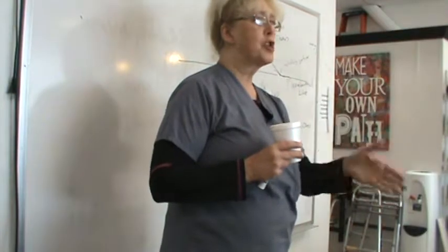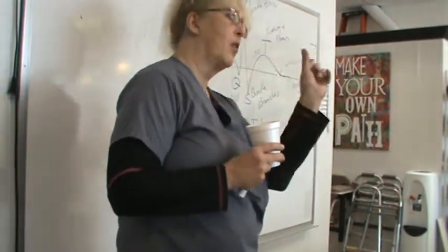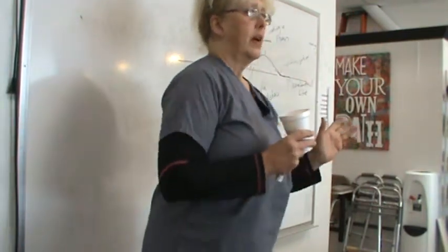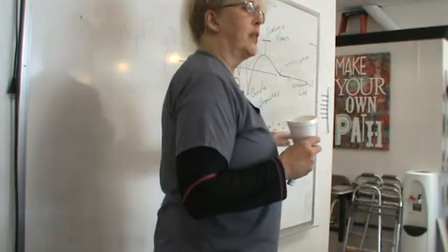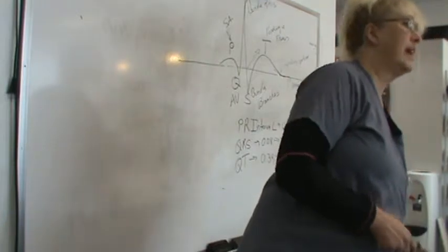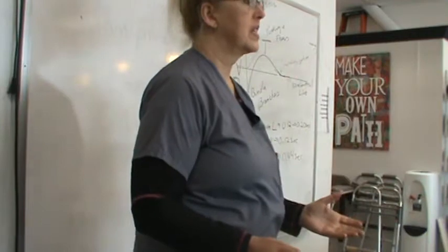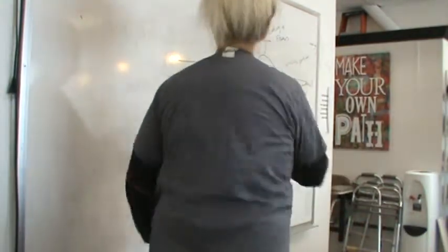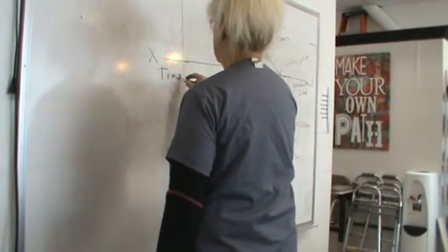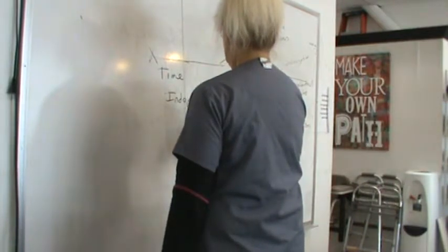But you always measure on the horizontal. See, that's the thing. You have to measure on the horizontal. We don't want you to measure angles and things like that. The distances are always going to be measured on the horizontal line. The x-axis is always going to be in time, right? It's our independent variable. You know that from statistics and economics. X-axis is time. It is an independent variable.